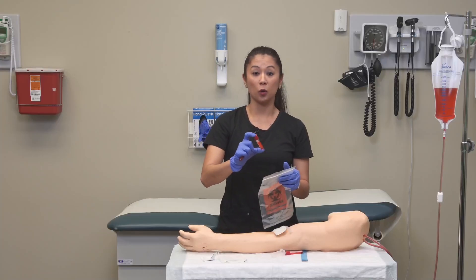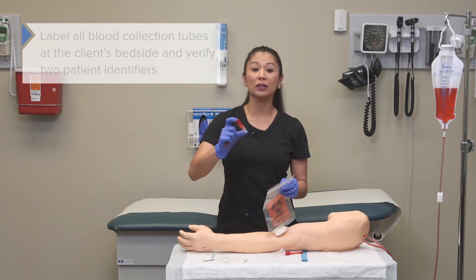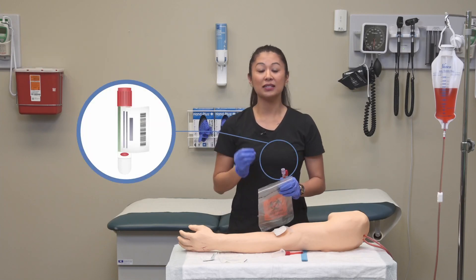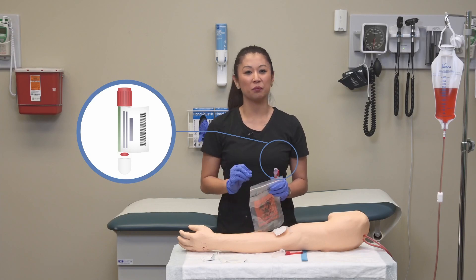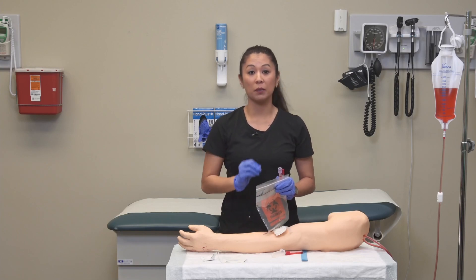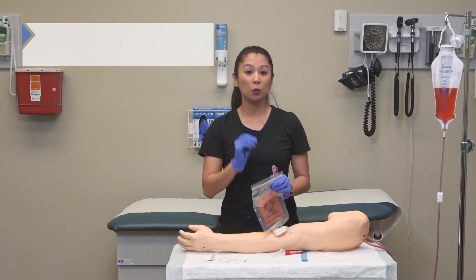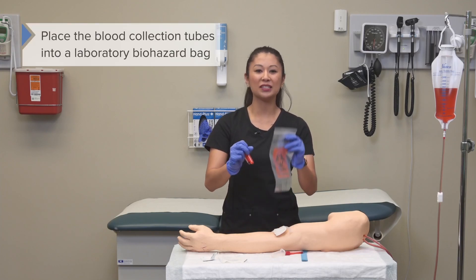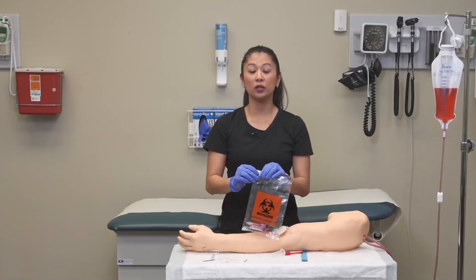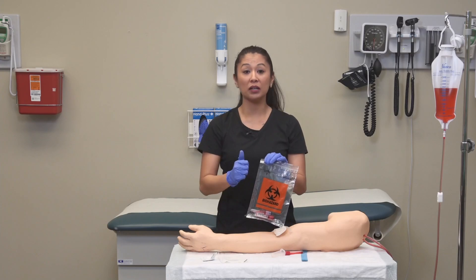It's also important to note that once you've inverted the tubes, you must label the blood collection tubes. Do this at the client's bedside to make sure you have the right patient and date of birth. You can get labels from the electronic medical record or the patient label — follow your agency's policy. Once labeled, place the blood collection tubes into the laboratory biohazard bag.